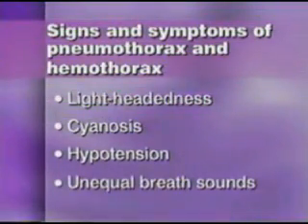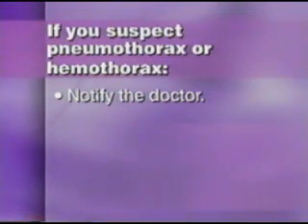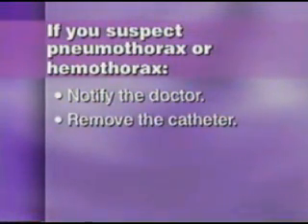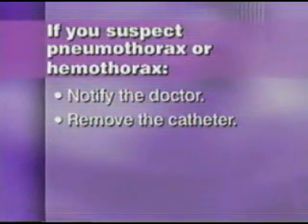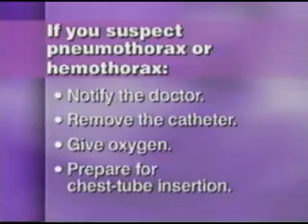If you suspect one of these problems, notify the patient's doctor, remove the catheter if you're trained to do so, or assist with removal of the catheter, give oxygen, and prepare for and assist with chest tube insertion.